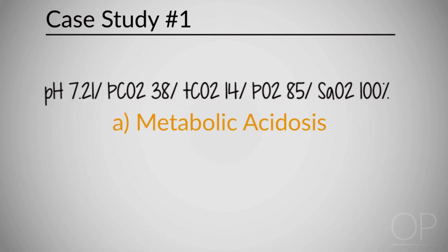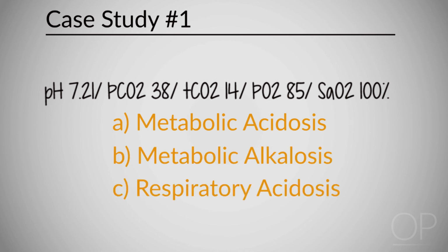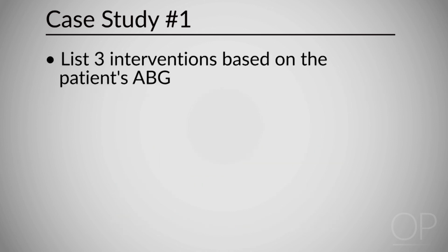Is it a metabolic acidosis, metabolic alkalosis, respiratory acidosis, or respiratory alkalosis? And number 2, based on the case study, list at least 3 interventions you might anticipate in response to the arterial blood gas.